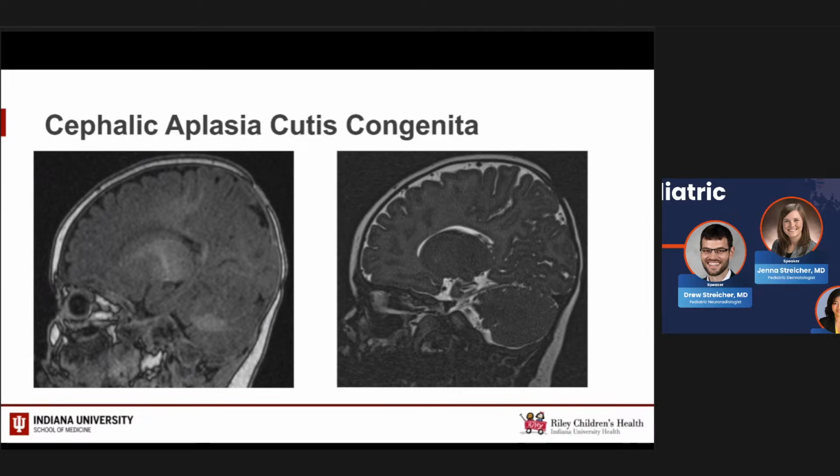Going off what we were talking about, I'm wondering if there's a little skin defect there, in the same region, high parietal area, that looks to be thin. There's probably a little piece of calvarium missing. Could that be the posterior fontanelle? Possibly, but it looks more posterior than I'd think.